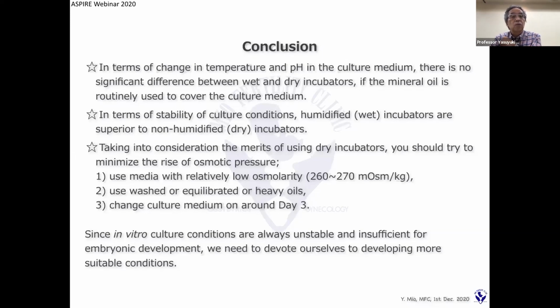Taking into consideration the merits of dry incubators, you should try to minimize the rise of osmotic pressure. 1, use media with a relatively low osmolality. 2, use washed or equilibrated or heavy oil. 3, change culture medium on around day 3.